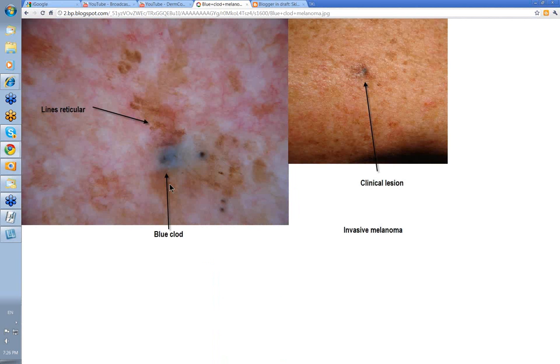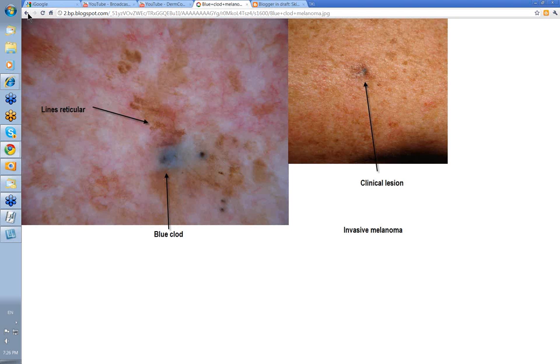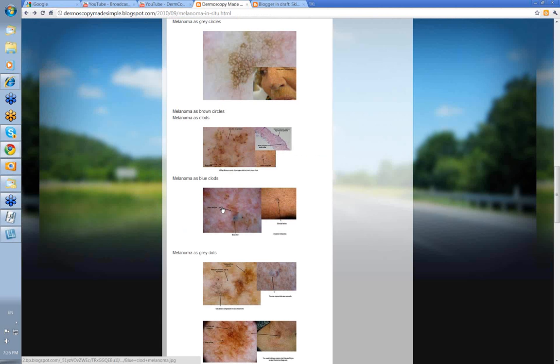Melanoma with blue clods. Often the differentials are either a basal cell skin cancer or a melanoma. You go looking to see if there are any arborizing or well-focused linear branched vessels because that points you more towards a basal cell skin cancer. Here though was a deepish blue clod of an invasive melanoma. This was the clinical lesion with the blue area corresponding. Some lines reticular round about, but blue clods as a marker of melanoma.